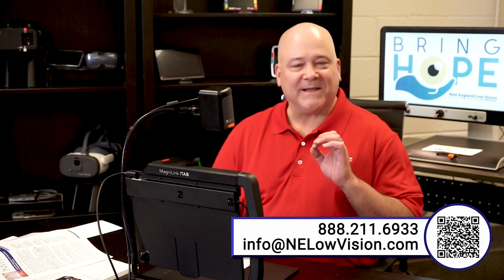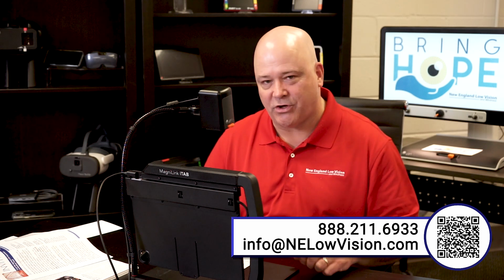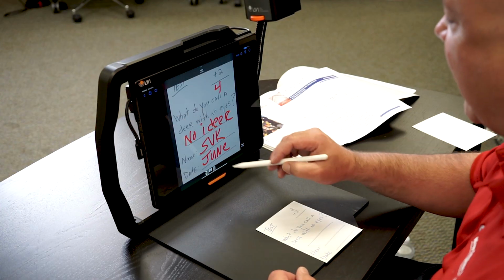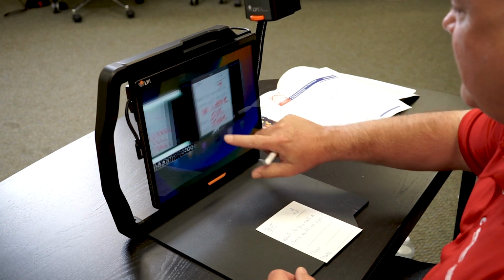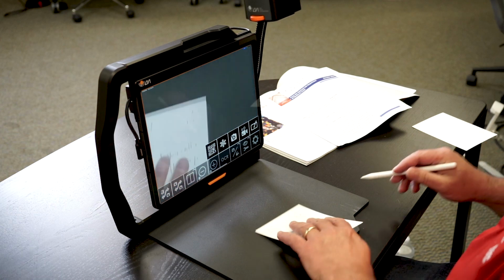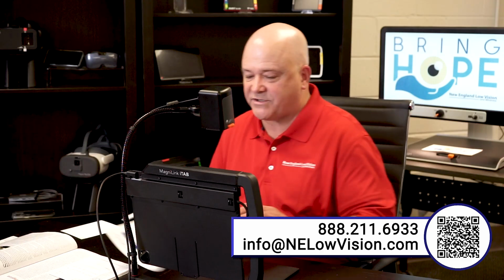Okay, the last part, or the two last things I want to show you, one is how you can use it to split the screen. So now I'm using the iPad, right? We're going to go back to our MagniLink viewer. Let's go back to a live shot. So here we are on a live shot.